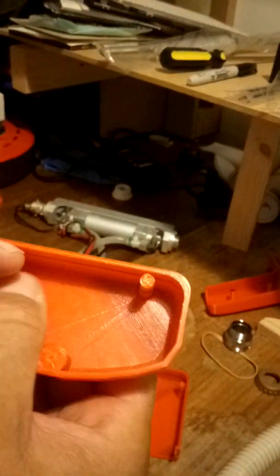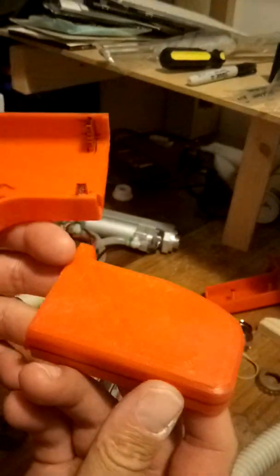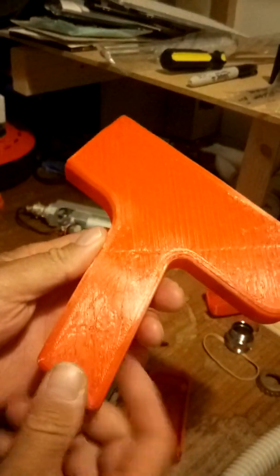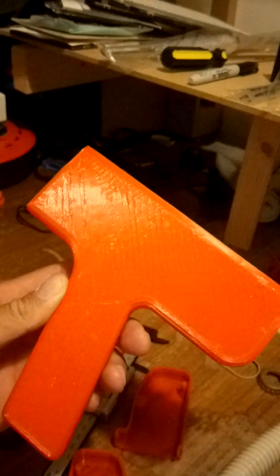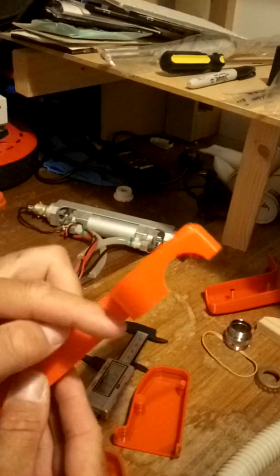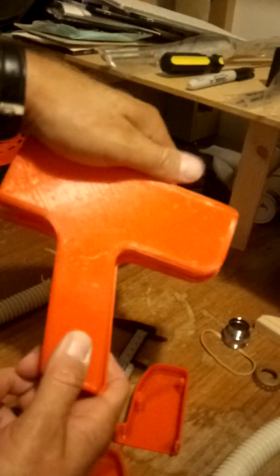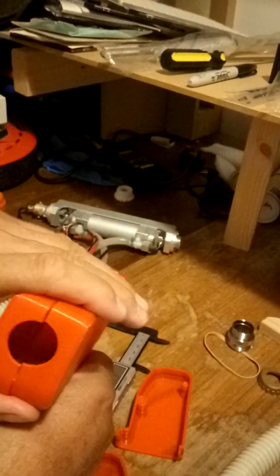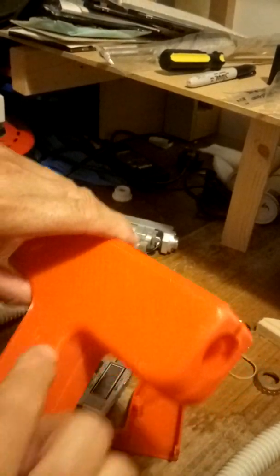I'm fascinated that the vectors used here show you how these were made, I find it truly fascinating. Now the reason why I've made this as a solid piece, can you see how that's all one thing? There's a very, very good reason for that. Some of the designs have this main block slightly proud sticking out and the handle inside to make it more aesthetically pleasing to look at. So where this at the moment looks like Thor's hammer, like that, I think that looks okay. But if you imagine it had a slight bevel across there, people think, oh, that looks much nicer for a handle. But you have a problem with that. It causes a stress and it breaks.